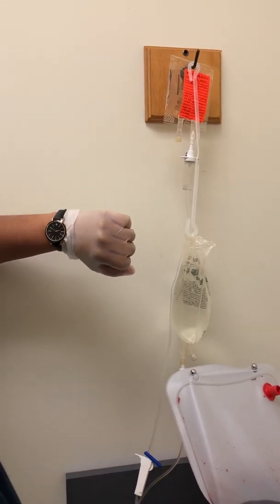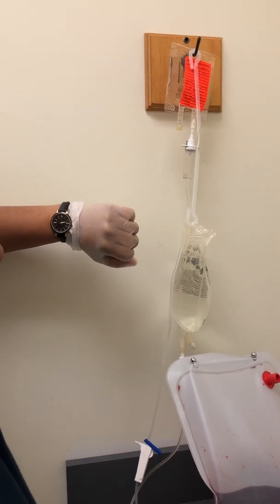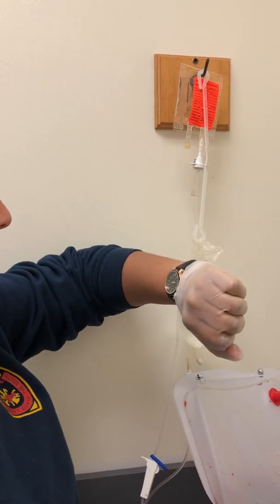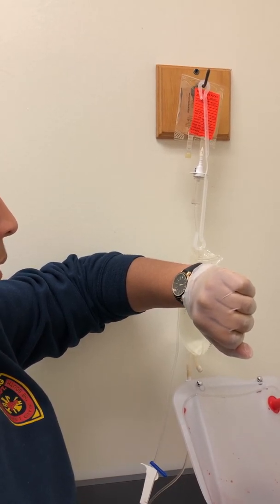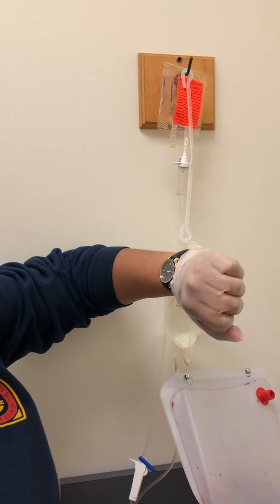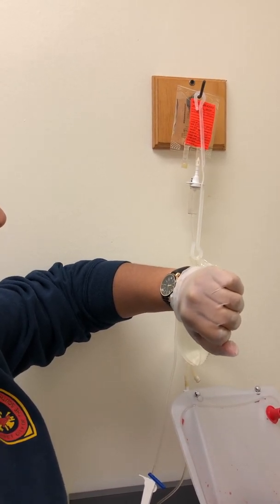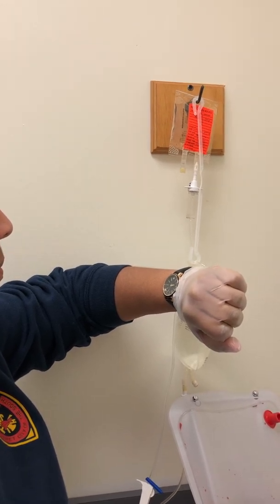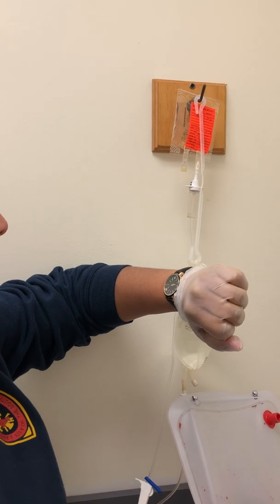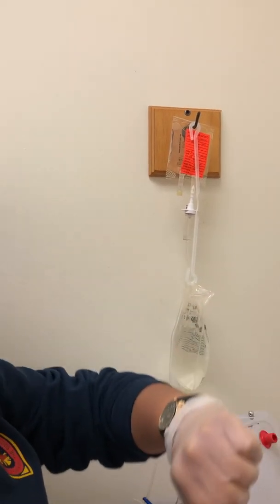1, 2, 3, 4, 5, 6, 7, 8. Okay, so I got 8 drops a minute.